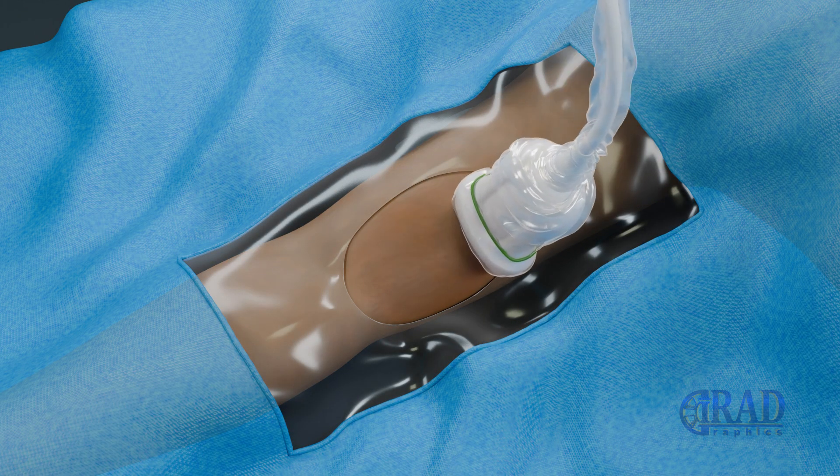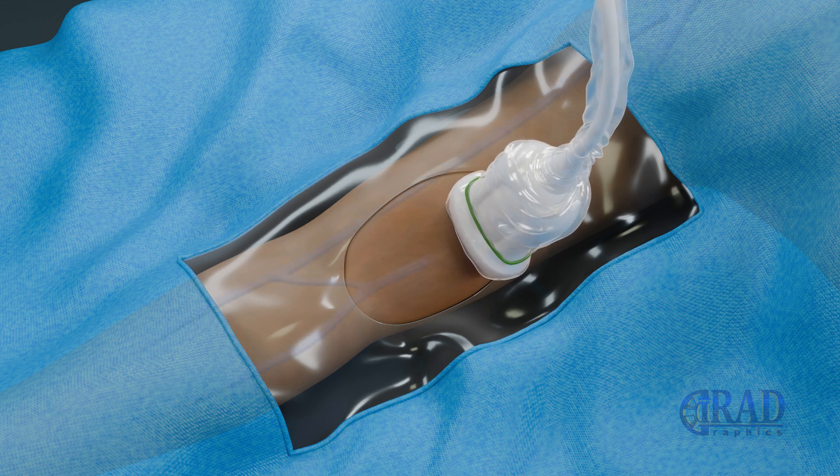Using real-time ultrasound guidance, the basilic or cephalic vein is identified for access. Local anesthesia is administered to numb the access site. A small skin incision using a blade is made and a needle is inserted into the target vein under direct ultrasound visualization.